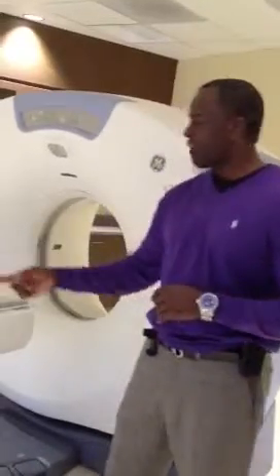see any abnormalities. Now, with the IV contrast, it's an iodine-based contrast solution which we inject intravenously. We'll start an IV, we shoot the contrast through your veins, it goes down and circulates through your heart, all the way through your limbs, through your organs, and comes back up through your veins. And what it does, it helps highlight the blood vessels, it highlights the organs, so the docs can get a good look at your organs as far as your liver, your spleen, your kidneys, and that kind of thing. And it tells if there's any other abnormalities.